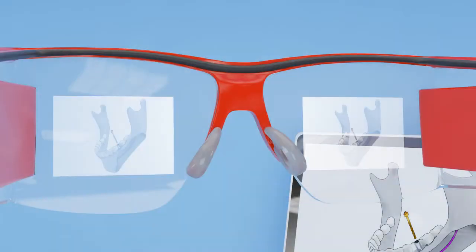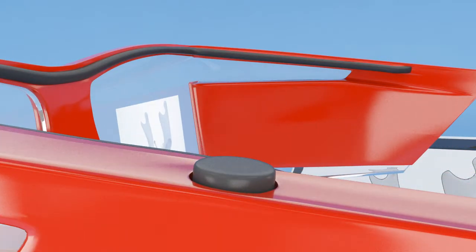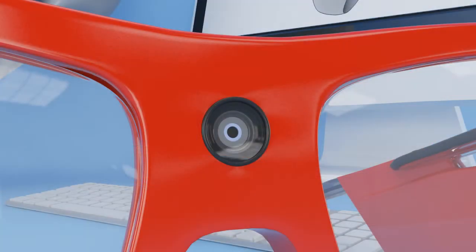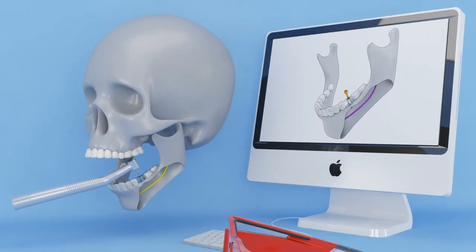A button located near the temple allows Foresight to be activated when required and turned off with ease. Foresight's high-definition camera is centrally located to track the lower jaw and drill piece through SIFT features that accurately correlates their positions.